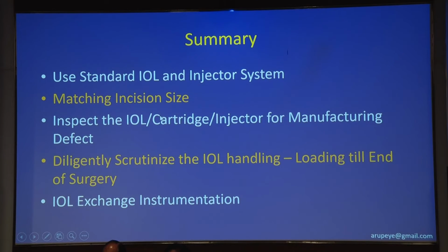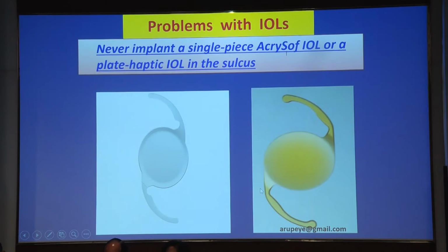And see, whenever we show a complication, an intraoperative complication, it is important to show the post-op situation. Otherwise, postoperatively, you have a lot of problems, but you give a wrong take-home message to the delegate. So whenever I show any complication, I make it a point to show the postoperative pictures. So this is a complication which could have been avoided.